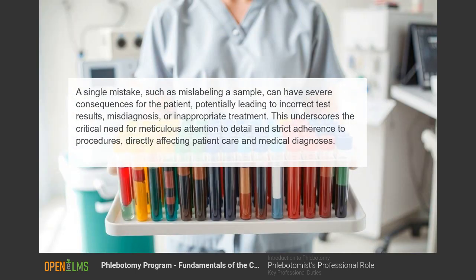A single mistake, such as mislabeling a sample, can have severe consequences for the patient, potentially leading to incorrect test results, misdiagnosis, or inappropriate treatment. This underscores the critical need for meticulous attention.